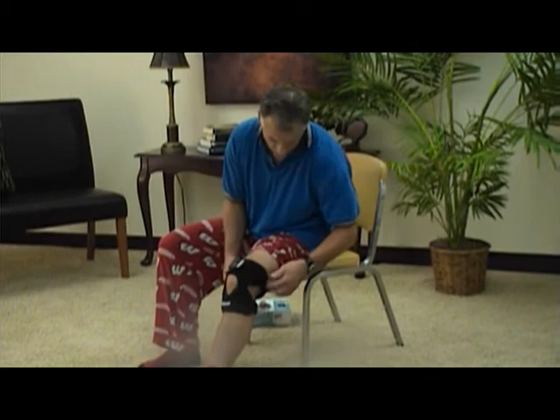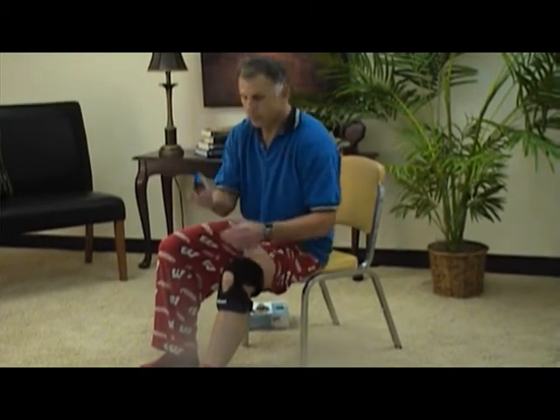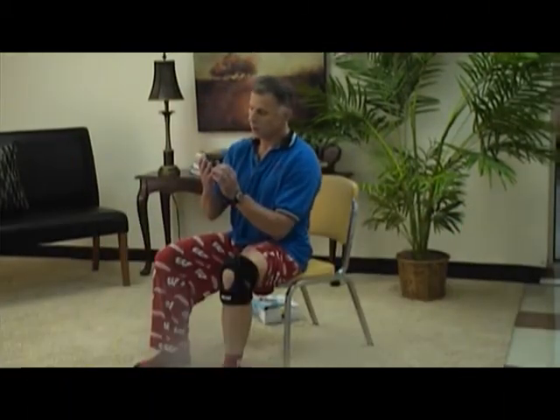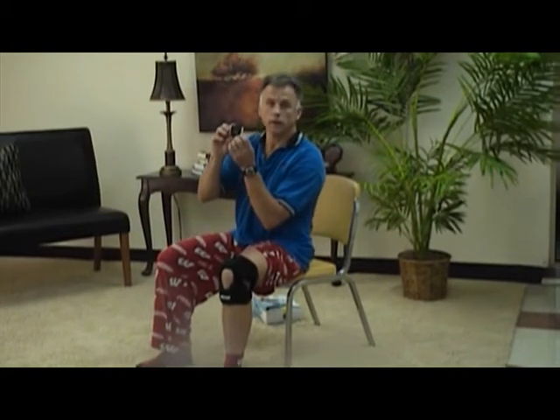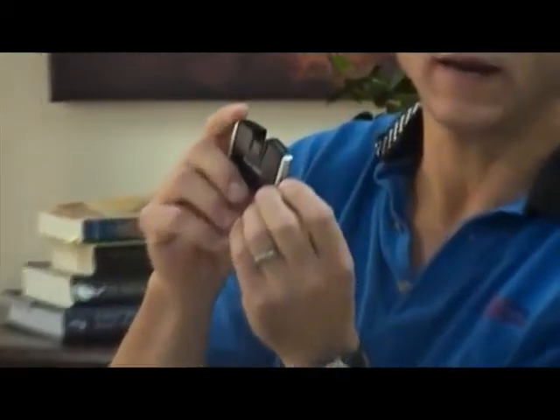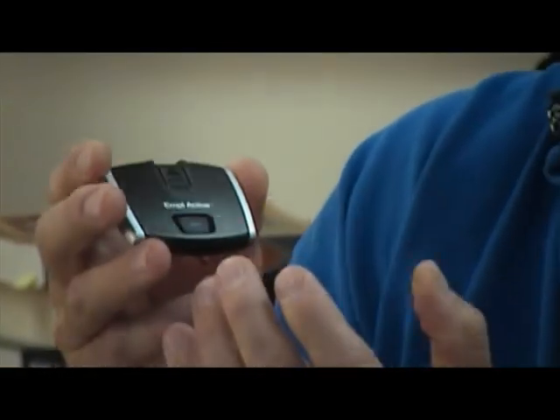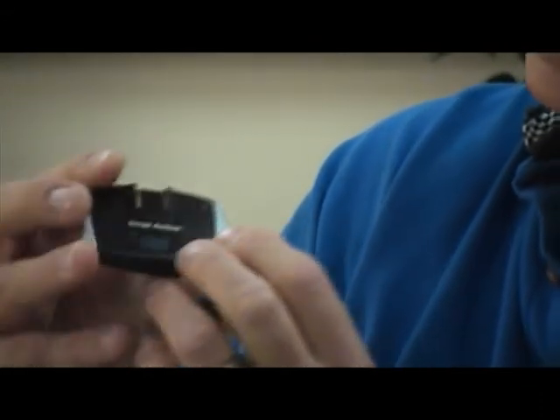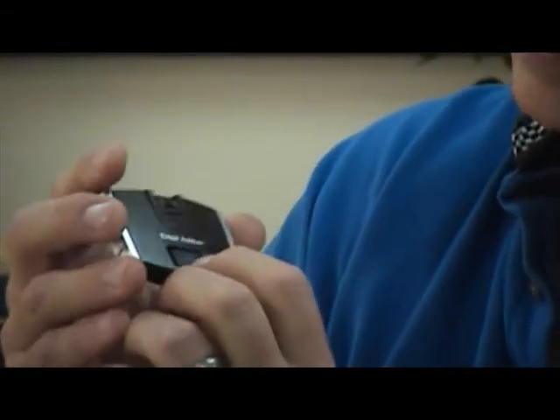Now, a really nice thing about this TENS unit is that right here is all the unit has for a power source. You simply plug it into the wall and charge it in about 2 hours. You put it on here like so. I want to review the modulator that comes with it, and it's so simple. There is a red button on top that's on/off. You simply push that, and that will energize it. You control the intensity of the TENS by the green plus button on the side. The one in front, the blue one with a negative sign, reduces the intensity. So let's give it a try here.